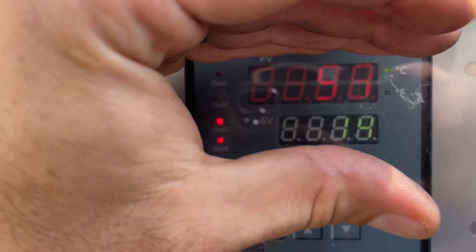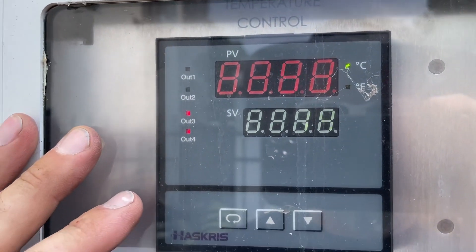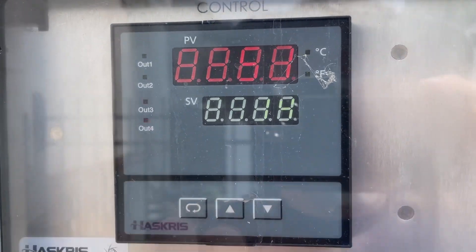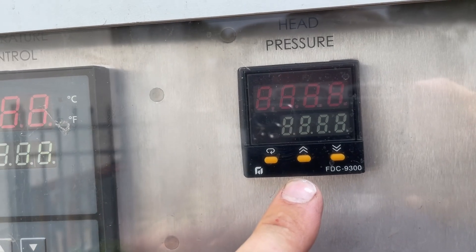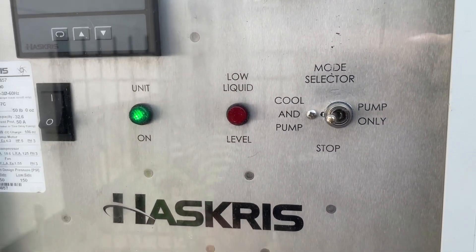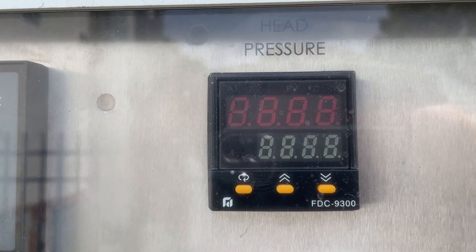I've got a PID controller here which I assume is for water temp. Some lights here. This one here is completely dead — I don't know if it's been like that or if that's part of the problem, but it looks like that's for the head pressure.